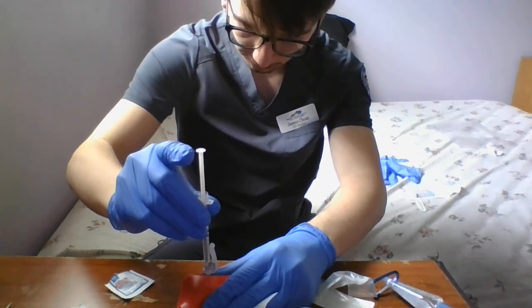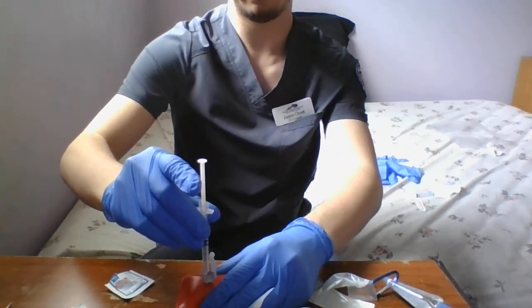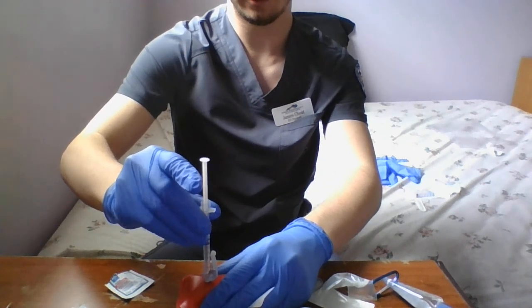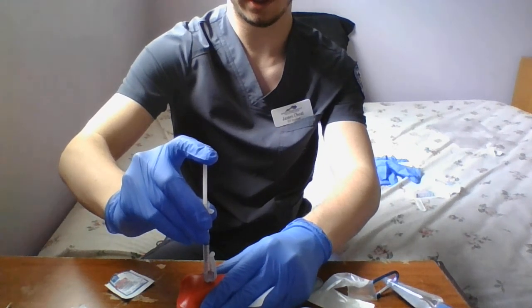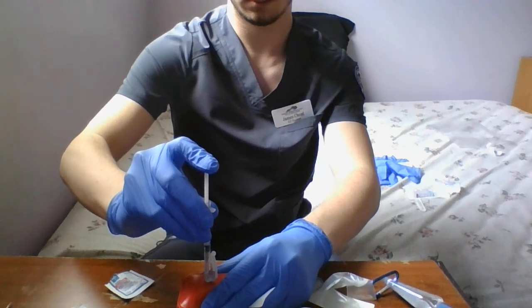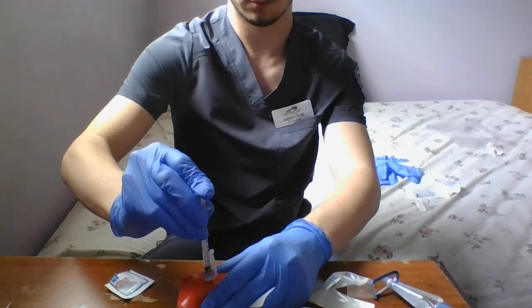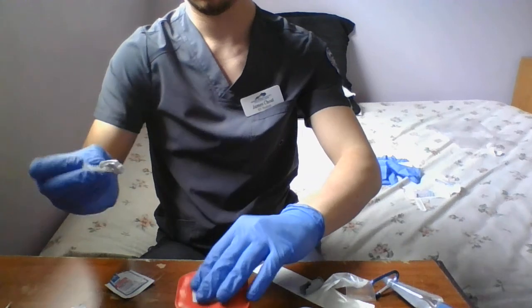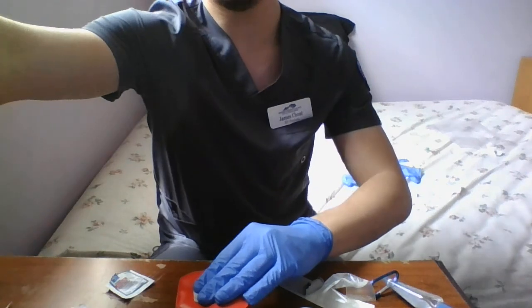Once again, you're going to put the needle in quickly, in one steady movement. Going to aspirate for 5 to 10 seconds. Make sure there's no bleeding, and then you're going to do 1 mL per 10 seconds. So 6 seconds today. Apply pressure to it. Then engage the safety mechanism.